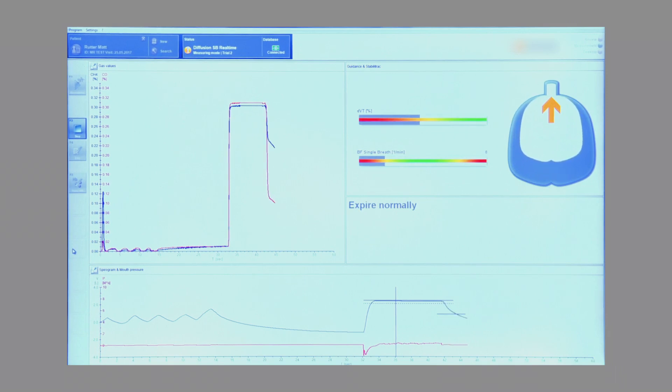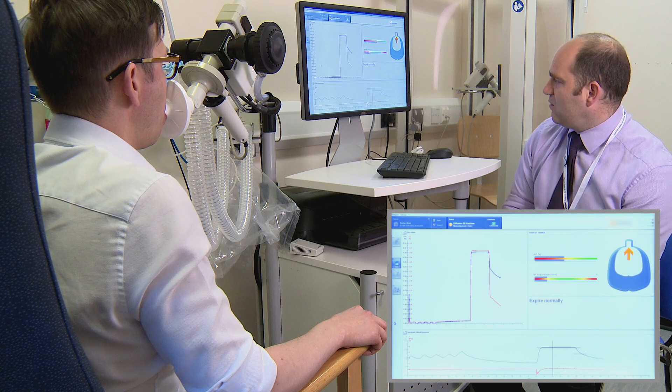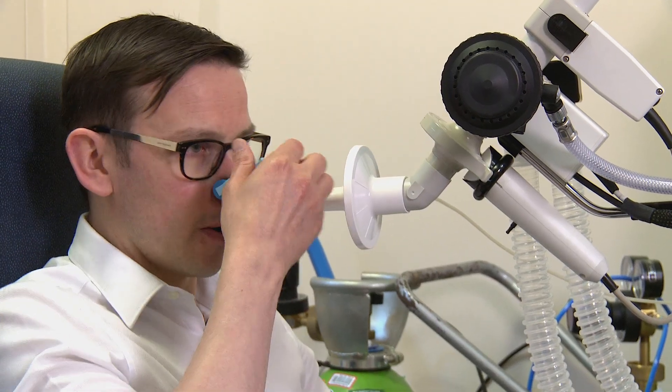Nice and steady, keep it going. Nearly there. A couple of seconds more, if you can keep pushing, all the way down. When you can't breathe out anymore, just come away from the tube. That's lovely. Pop the pegs off there.